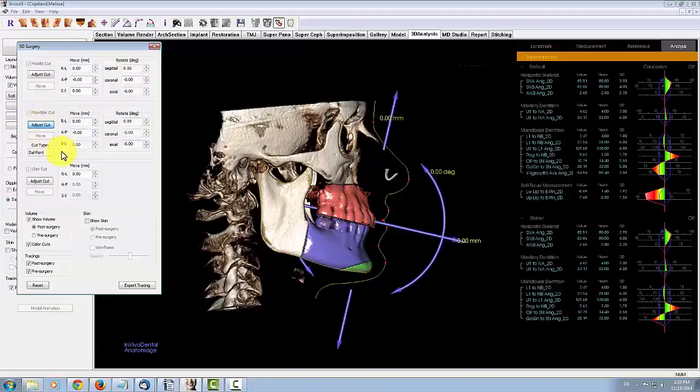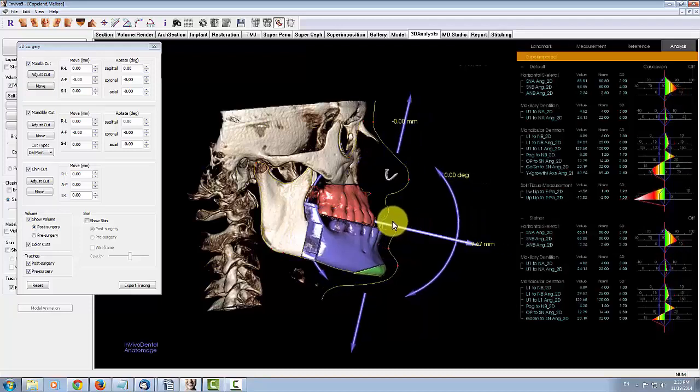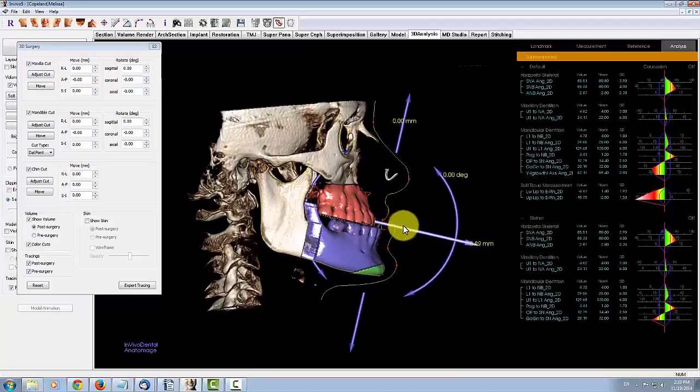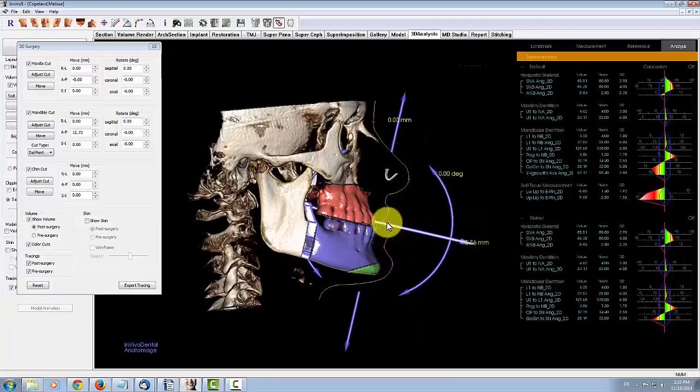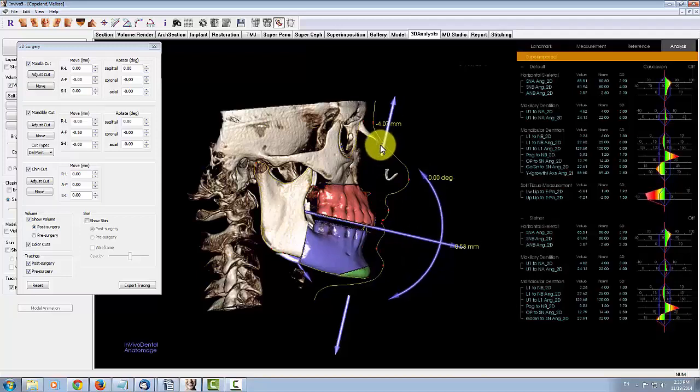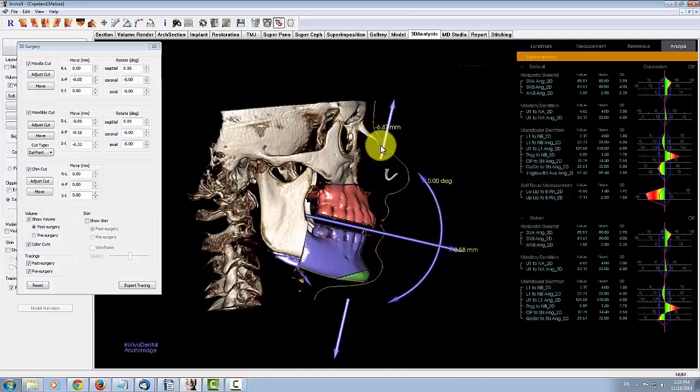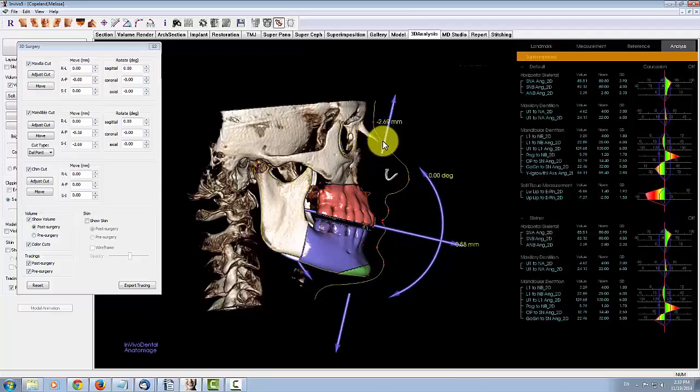When you are done adjusting the cut, you can simulate surgery movement by using the Move Widget tool. Simply click and drag the widget tool in the desired direction. Notice how the 3D analysis measurements in the text view on the right update as the surgery movement is performed.